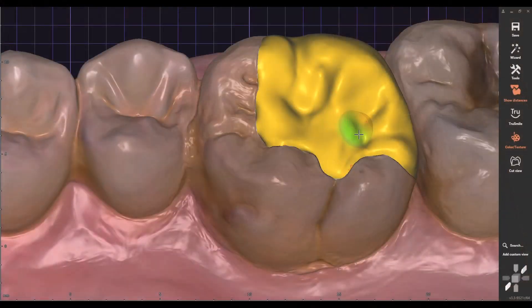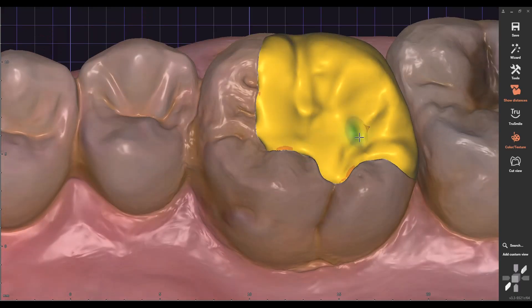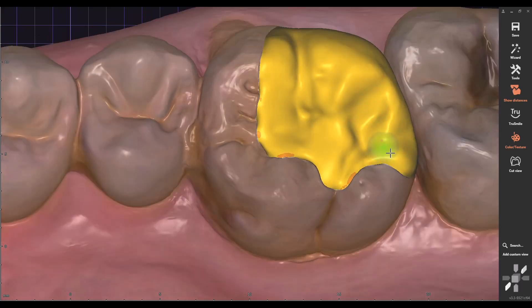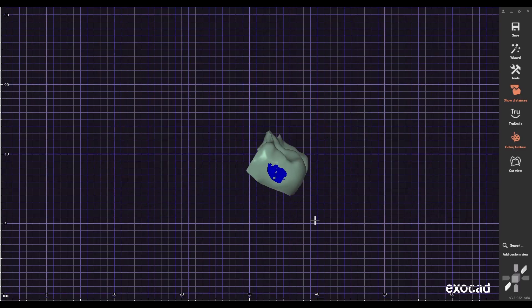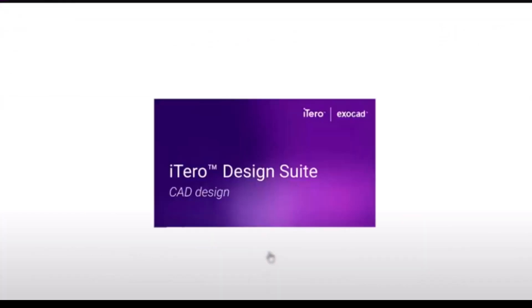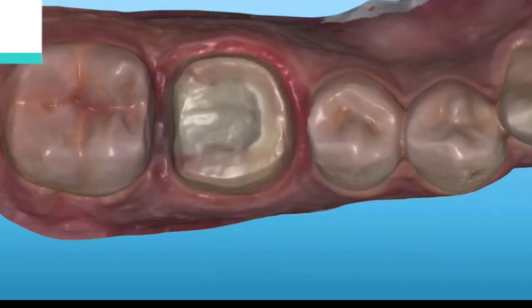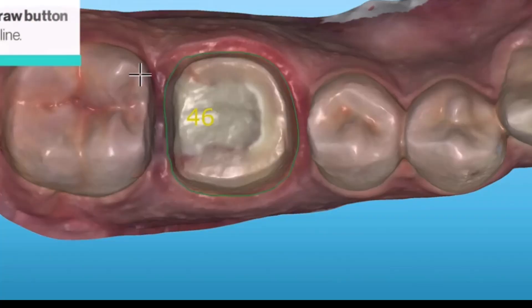We've exported our STL file from Itero and now we are finishing the design in ExoCAD — this is the full version. We're going to finish the design and then export the file to send to the SprintRay. If you didn't have a full version of ExoCAD, you can actually use Itero's design suite, which allows you to do a crown design, inlay, onlay, or veneer directly in the Itero software, and from there send it directly to the SprintRay software to begin your print.